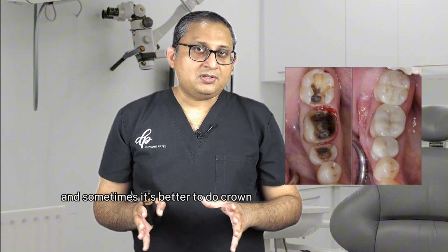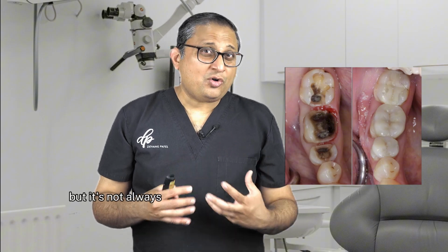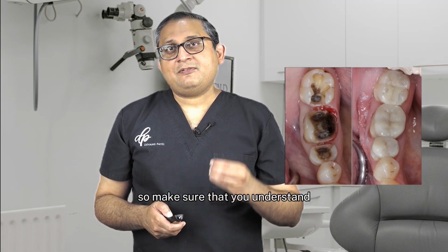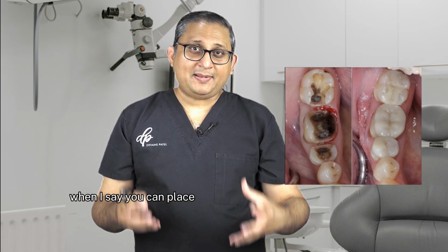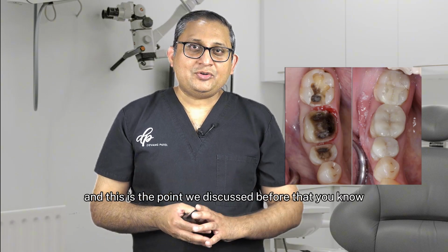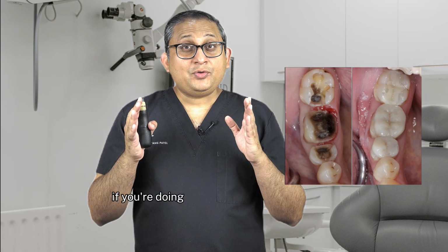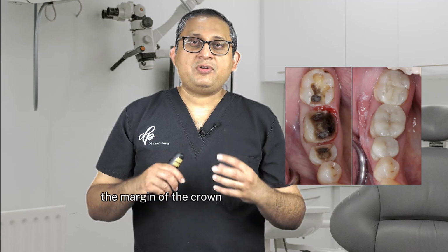So make sure that you understand your limitations, when you can do DME and how you can manage these cases. And sometimes it's better to do a crown than struggle and do DME, because we want to do adhesive dentistry, but it's not always possible when you cannot isolate the tooth. So make sure that you understand which are the cases where you can do DME, and most of the time when I say you can place the matrix band and isolate the area, that's when you can do DME. And this is the point we discussed before, that when you're doing onlays, it helps when you do DME. If you're planning to do a crown, then DME doesn't work. You need to make sure the margin of the crown is on the tooth.